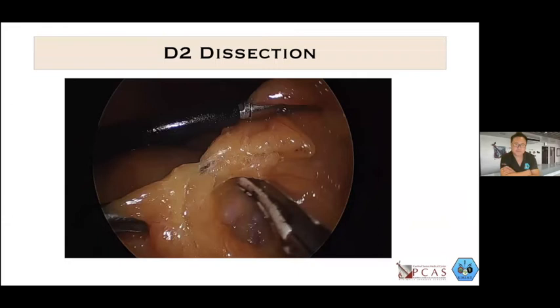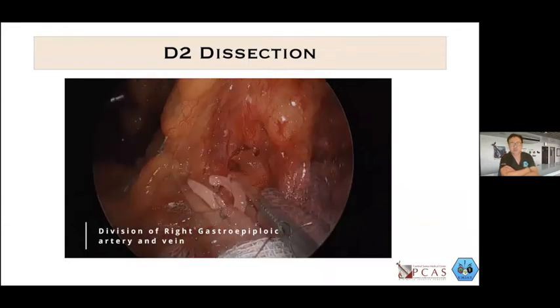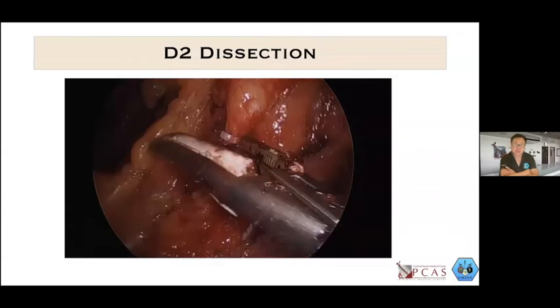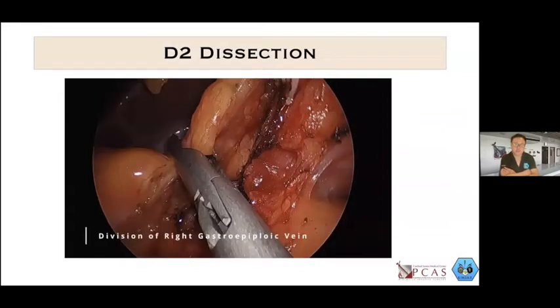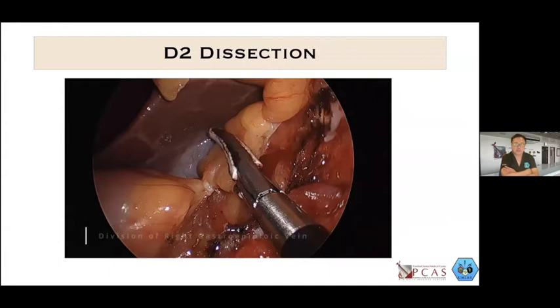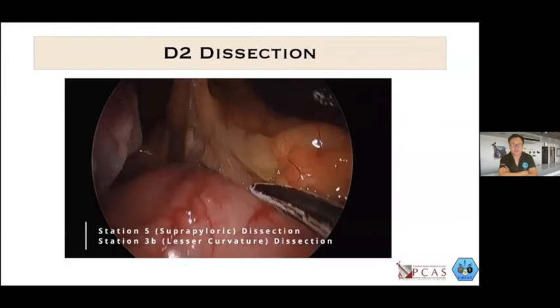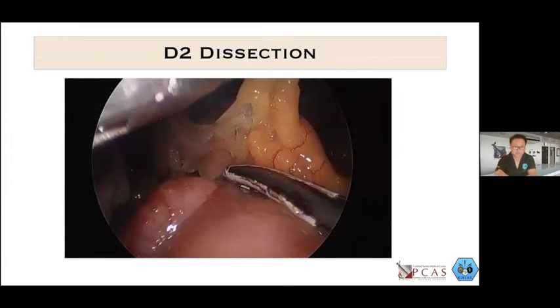As Vimal has said earlier, when we first started, we started off with a jaundiced view of everything. Everything is either reddish because the early machines that we were using are, I think, the single chip video systems. So right now, because of the advancement in technology, we have a better appreciation of the anatomy and, of course, the different anatomical spaces of the area. So we'll just move this forward in the interest of time.